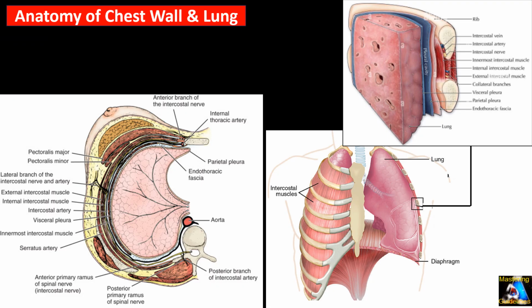Hi everyone. Nowadays, many academic centers add on ultrasound of the lung to the curriculum for medical students, and it has been recommended that any GP, a general practitioner, ER resident, and ultrasound tech, any modality and specialty, should be familiar with the ultrasound of the lung.